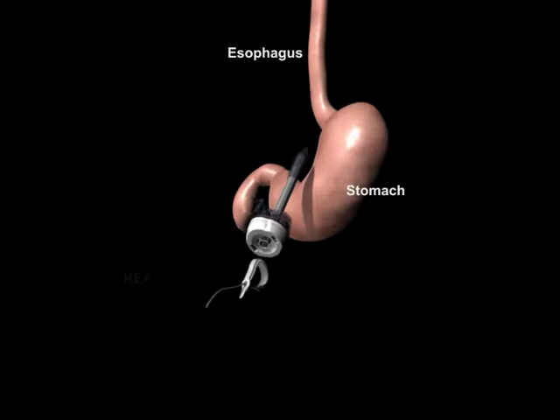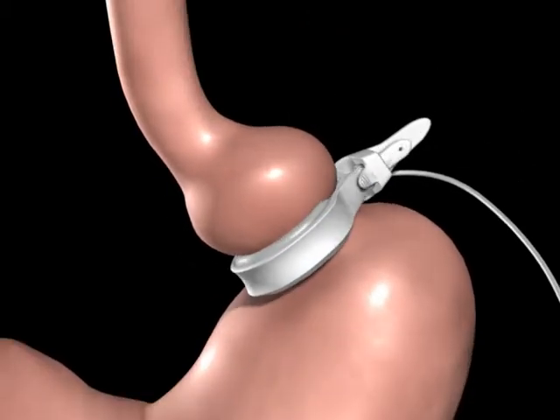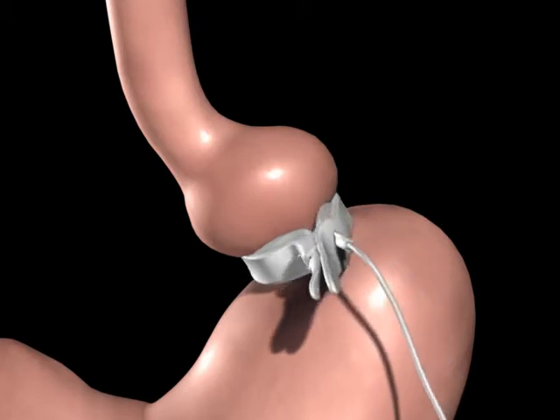The Realize band is introduced to the abdomen through a trocar. It is then positioned around the upper portion of the stomach and secured using the locking mechanism.